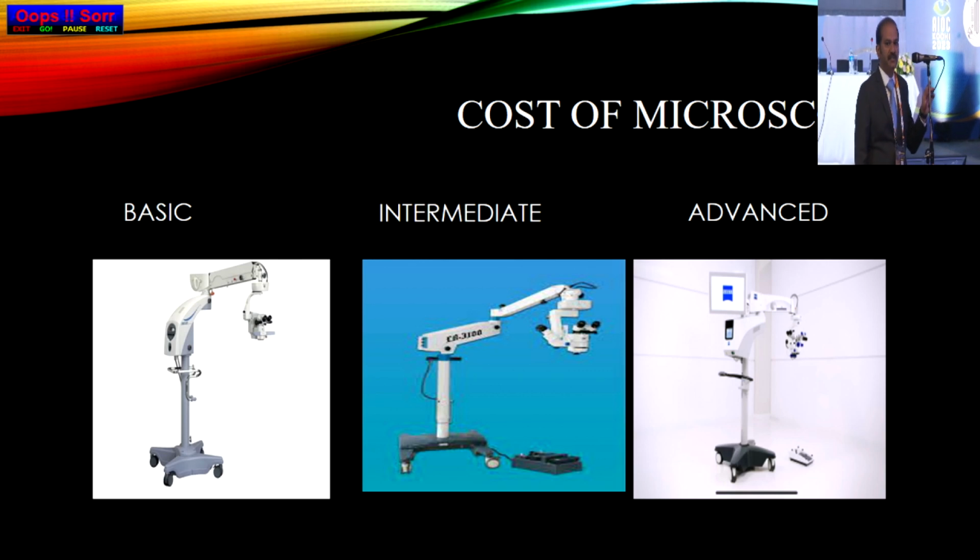Next, the question is, how do you compare a stepwise magnification with a continuous zoom? Basically, I believe for pre-presbyopes, step magnification is definitely good, but once you become a presbyope, it is always better to go for the continuous zoom. Continuous zoom has other advantages when you are going for recording, because a recording system is very important. I don't recommend high-end recording systems, but you definitely need at least a small indigenous recording system initially to start your practice. Always audit your own surgeries. That's how you improve every day.